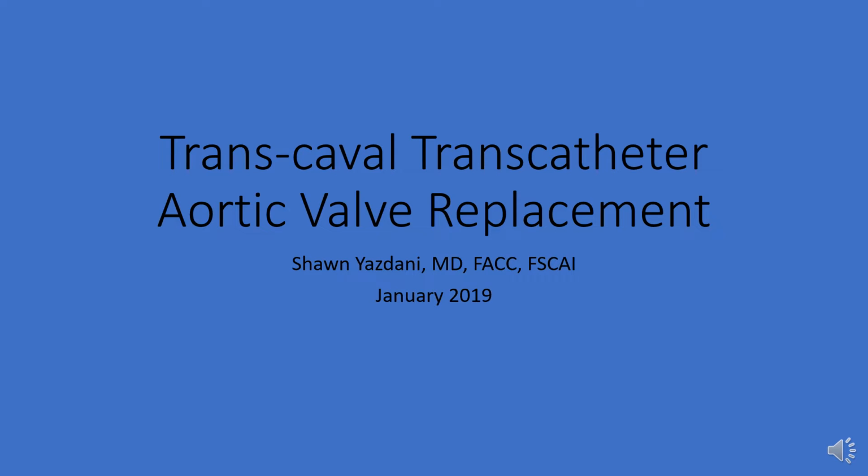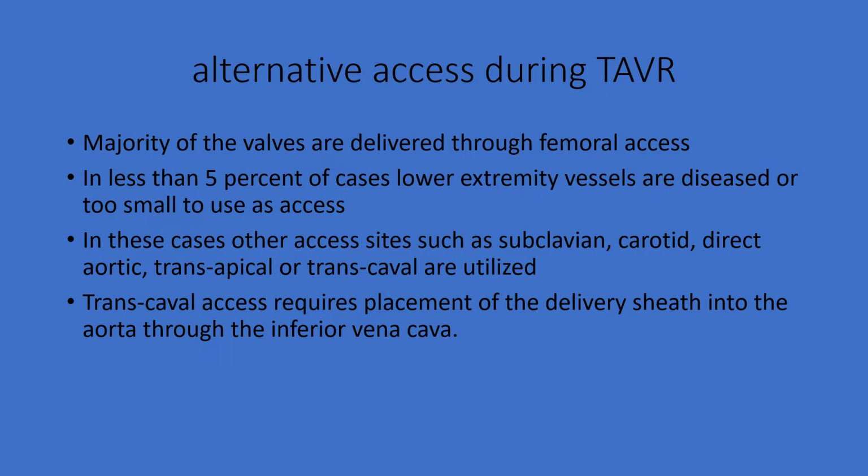Hi, today I want to go over a case we recently did utilizing the transcaval access to deliver the aortic valve during transcatheter aortic valve replacement. Majority of the aortic valves are delivered through the femoral access during transcatheter aortic valve replacement.